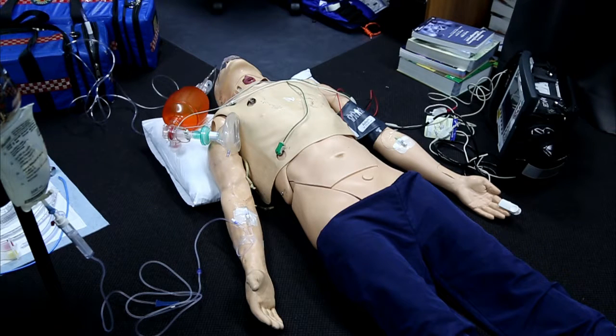Okay, so firstly the general setup of the patient prior to the attempt being made. Monitoring, so BP, ECG, SpO2 and end-tidal CO2 all need to be on and working. Nasal cannula at 15 litres per minute plus mask O2 on and working. IV cannula connected to fluid and running. Non-invasive blood pressure on contralateral arm and BP seen. Spare cannula in situ and a bag valve mask connected to oxygen.